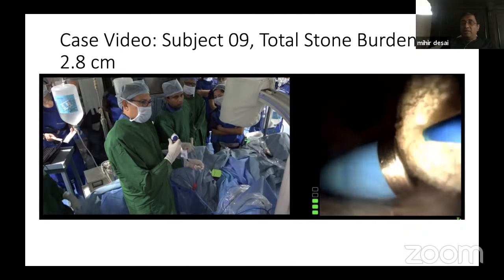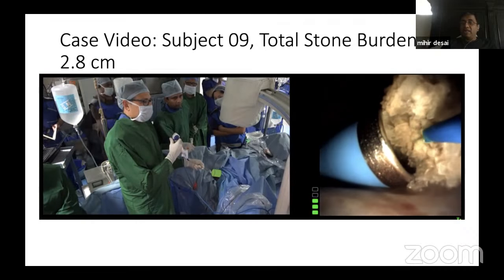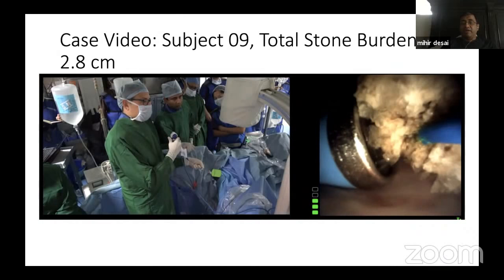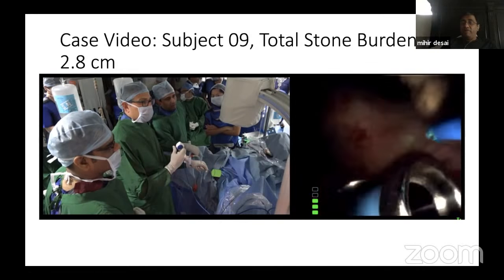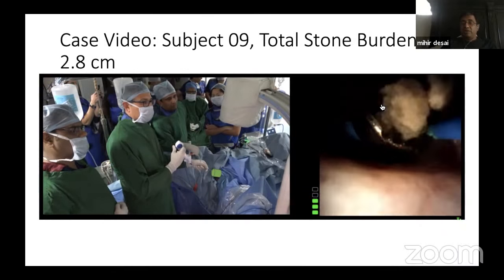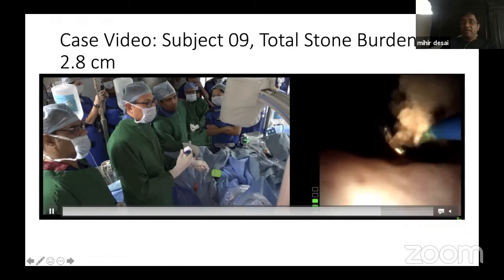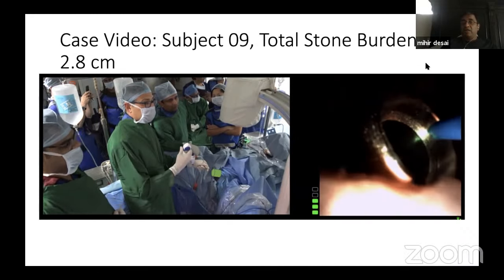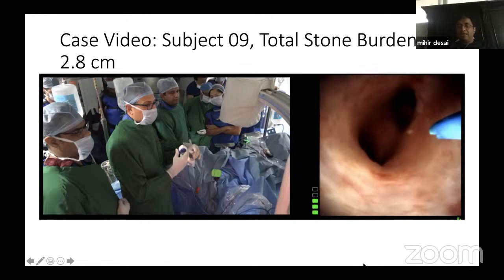And during the dusting process, you can see that there is immediate evacuation of fragments. There is not a dust storm that you typically see during stone fragmentation, because the flow is going away from the ureteroscope towards the percutaneous catheter. The percutaneous catheter tip is reinforced to be laser resistant. And as you can see here, even bigger fragments are aspirated because there is no competing instrument going through this percutaneous sheath, so the entire sheath lumen is available for aspiration of these fragments. Even the effect of suction to keep it mobile increases as the stone becomes smaller. And so as you can see here, you can get complete clearance. One thing that was subjectively very clear is that the amount of debris and dust that you typically see stuck to the mucosa is also not present.